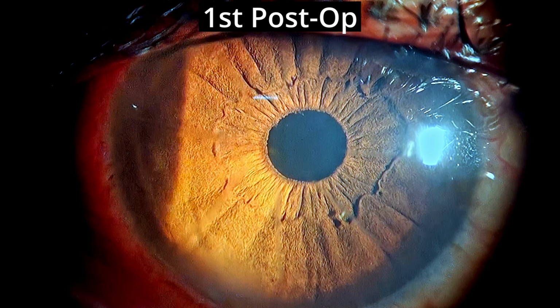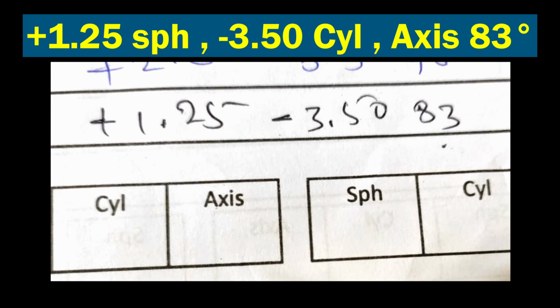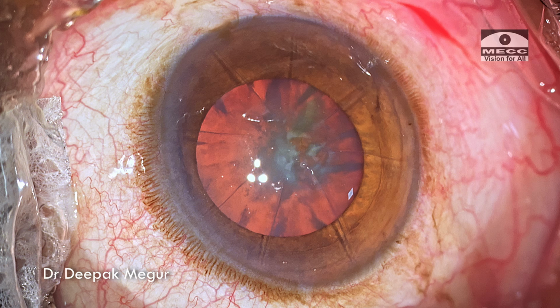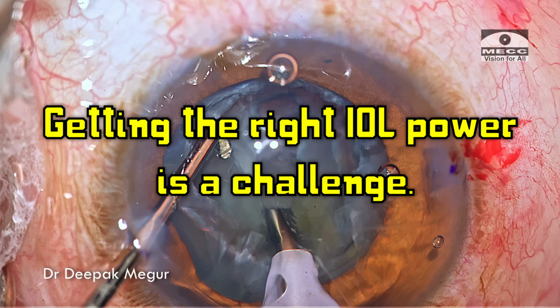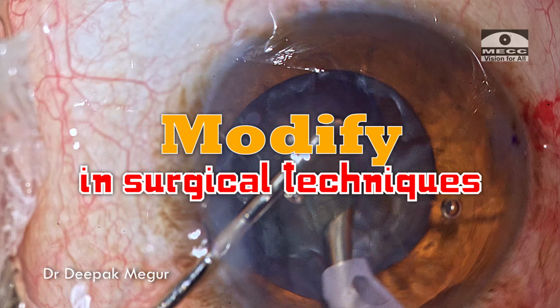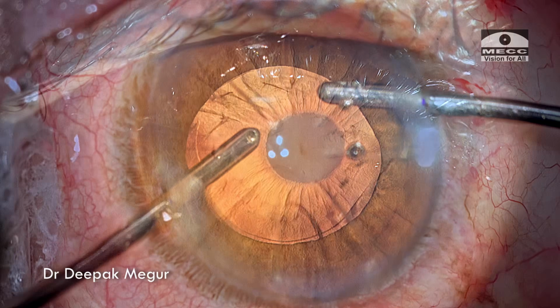So these are the post-op pictures of the patient, and this is the post-op refraction after 15 days of surgery. The spherical error is not significant, but there is a significant amount of astigmatism. That is because of the cornea, which is, to summarize, we're performing cataract surgery in an eye that has undergone radial keratotomy previously. Getting the power of the intraocular lens right is going to be a challenge, and then we need to modify our surgical technique in a certain way to ensure that we don't have any intraoperative surprises.